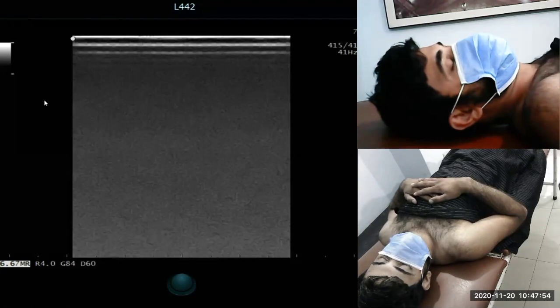So, we have divided the body into different segments like face and neck, the chest, pericardial region, and axilla, the abdomen, in which we include the abdominal wall, the abdominal viscera, retroperitoneum, pelvic organs.